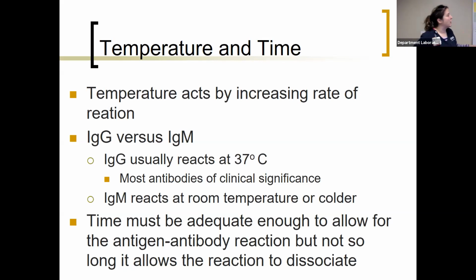Right, so that's why temperature is so important in blood bank. Also time. We want to allow enough time for that antibody to bind to the antigen on the cells. So it's very important, especially if you're using commercial antisera, to read your manufacturer's package insert. As we start going into phenotyping and certain things like that, they will all have different incubation times, okay? Typically, in blood bank, your incubation time is going to be 15 minutes, okay? That's usually a good incubation time.